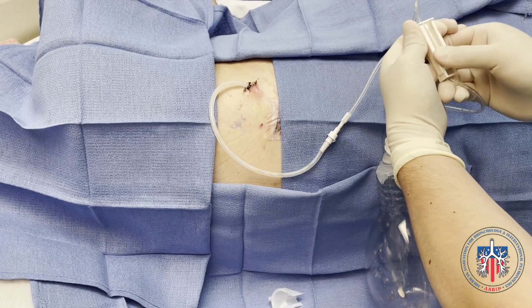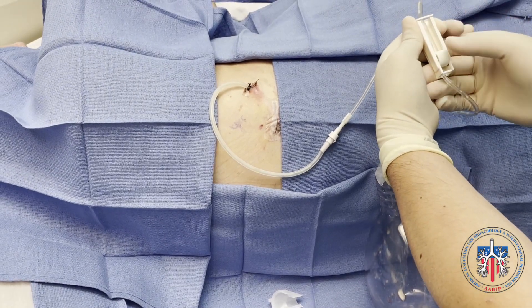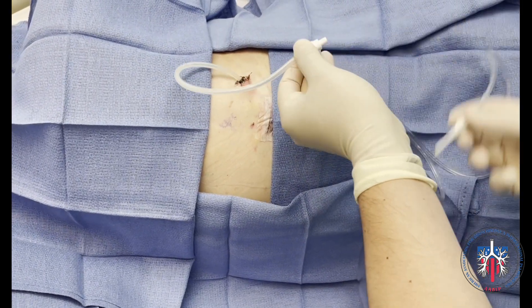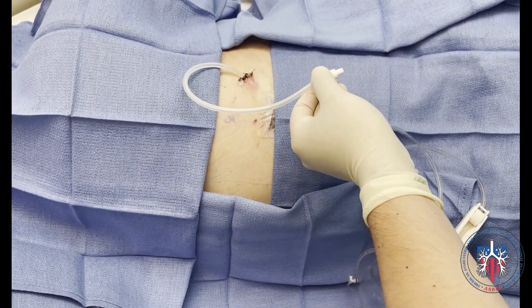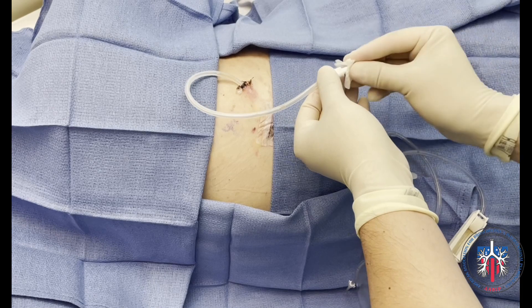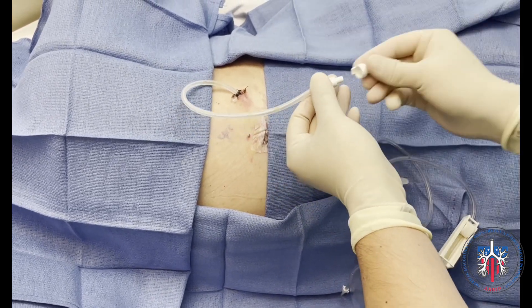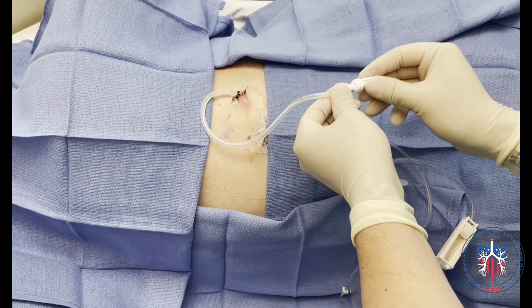Once drainage is complete, the dial is moved back to the down position to lock the drainage tube. The pleural catheter is then disconnected from the drainage bottle. The access tip of the pleural catheter is then cleaned with an alcohol pad, and the valve cap is secured by attaching it to the access tip and locked in place with a twisting motion.